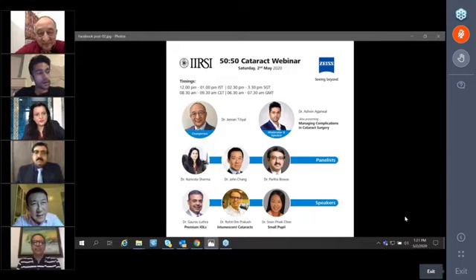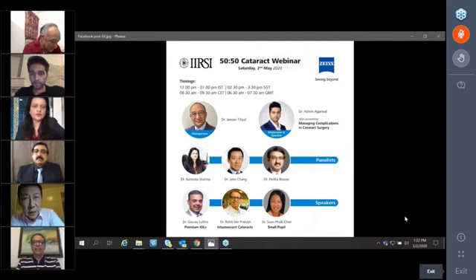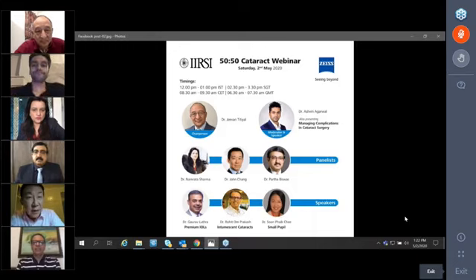Fantastic, thank you, sir. Anybody can answer this question because it's more specific. Can I say something? For the younger ones, they usually have cataracts, so their vision is already compromised. They're used to the glare and the halos, and I find that if I put multifocal IOLs, they adapt very, very quickly. They hardly ever complain because already their vision is compromised.